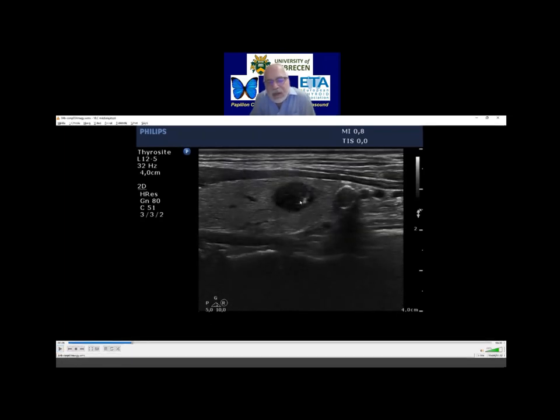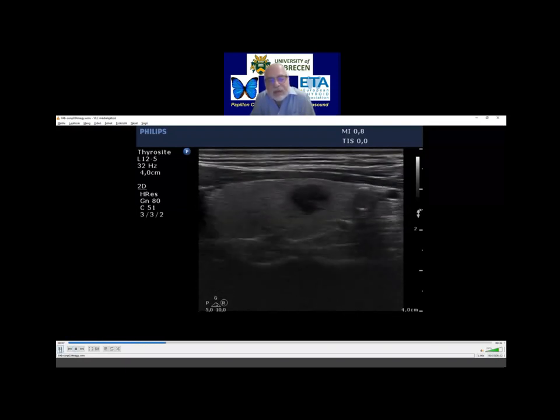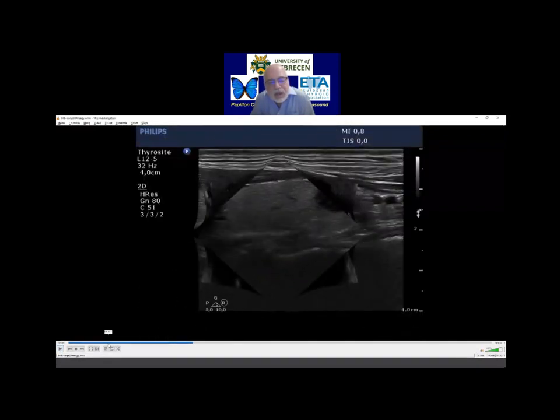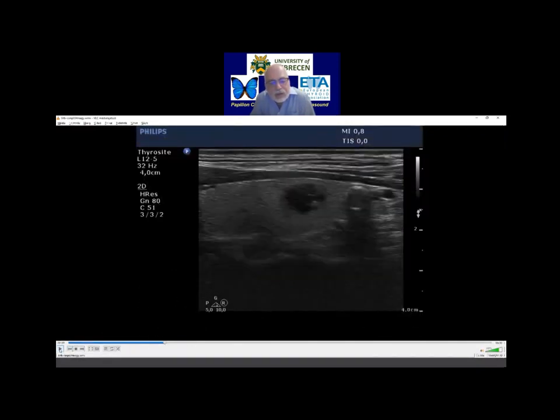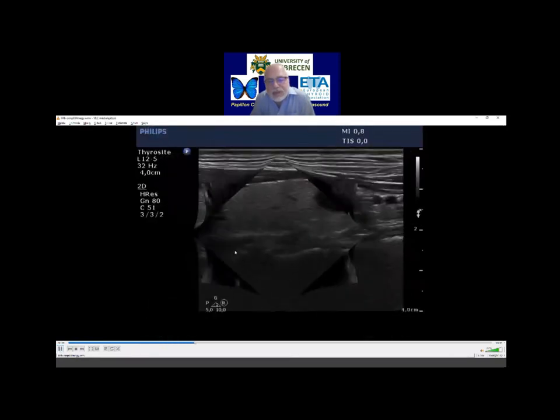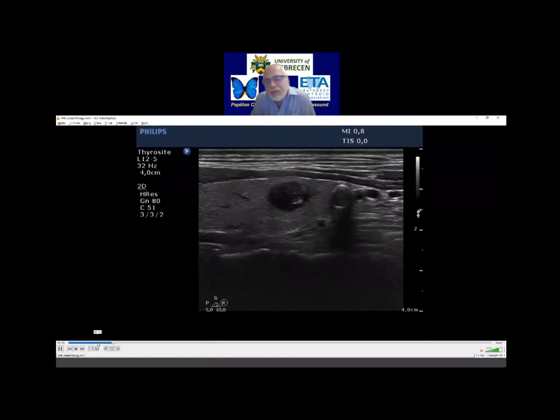We should consider in this case that this could be a microcalcification. Here and here we can see it, but not on this part of the nodule. This area also has some cystic component, so microcalcification should be considered. It proved to be a benign nodule and had no calcifications, but I think that is important.